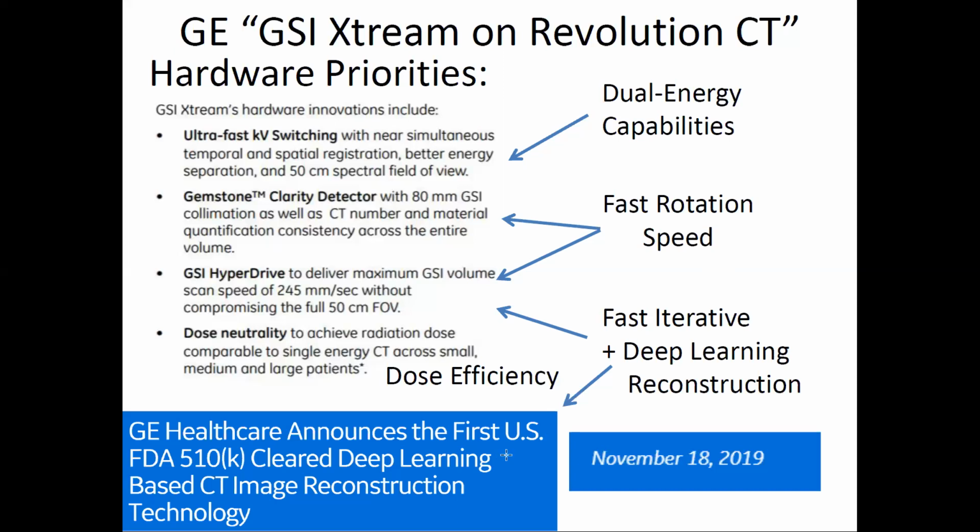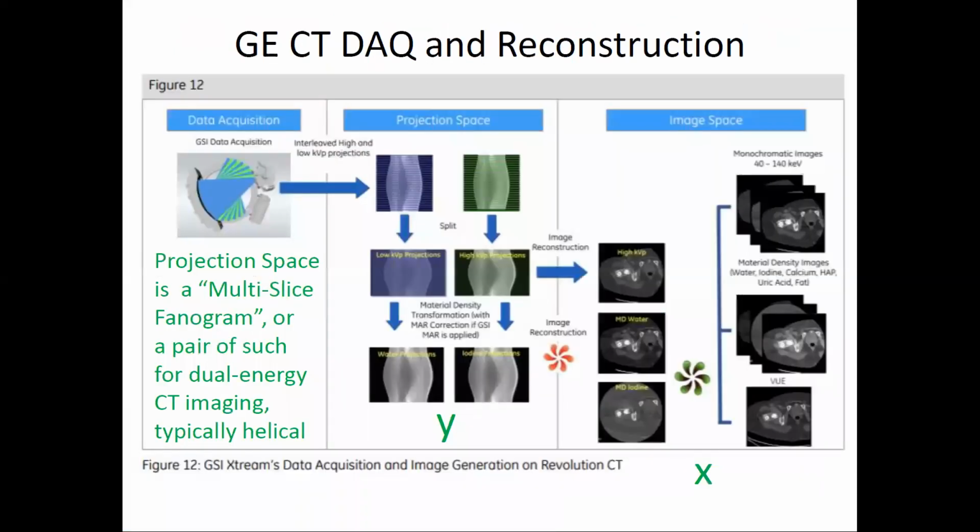As we're going to see, that helps, and as we heard on that earlier slide, helps with the speed with which you can do your reconstruction. Also, it's a different quality of reconstruction. We'll see what that's leading to. It's a many-fold complex impact that that's having. But this is the first clinical system. Well, they call it the first for reconstruction. The others are image to image. We'll talk about that in a minute.